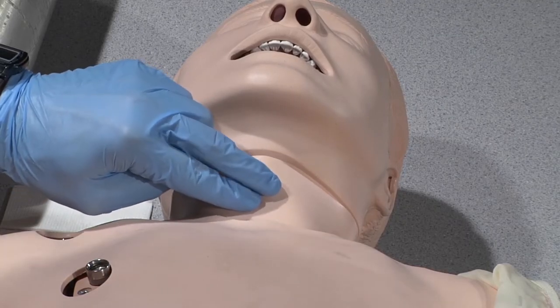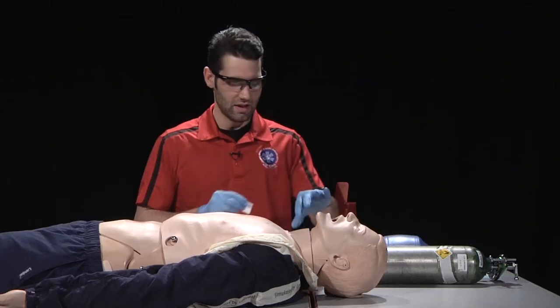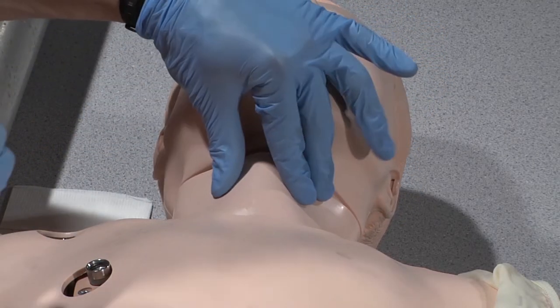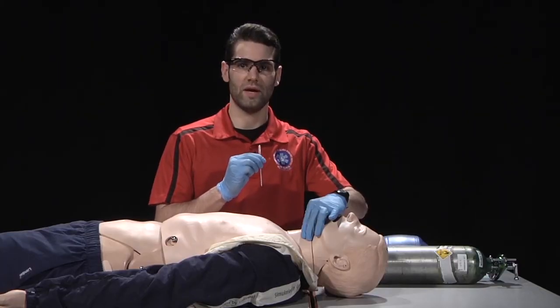Palpating the neck to locate the cricothyroid membrane between the thyroid and cricoid cartilage, cleanse the site with an appropriate solution, stabilize the site and insert the needle at a 45 degree angle through the cricothyroid membrane.